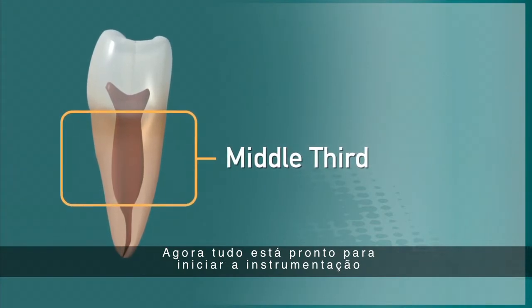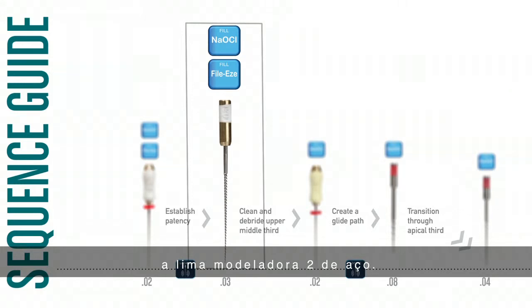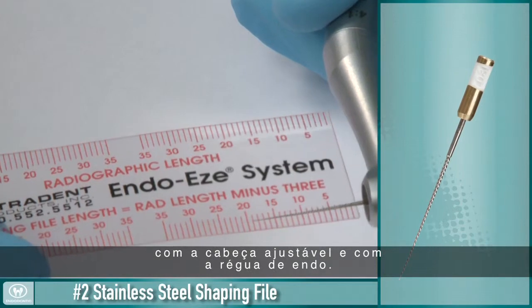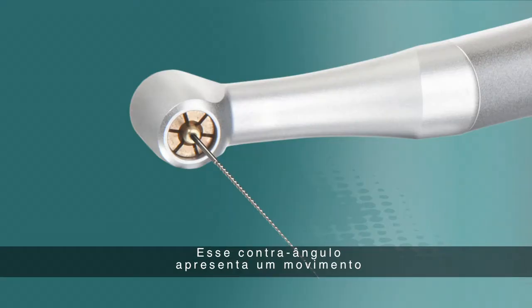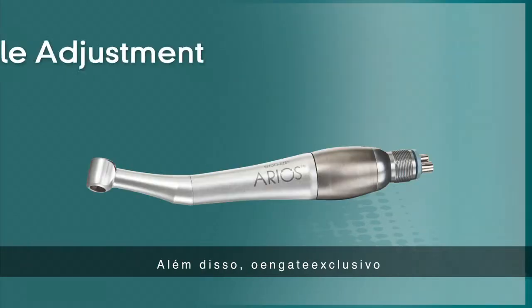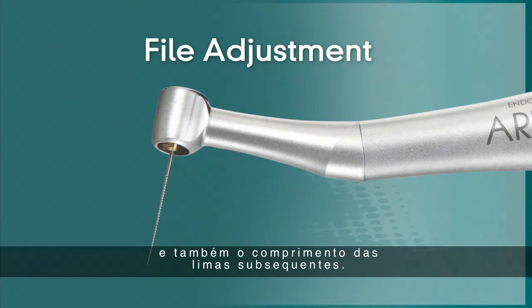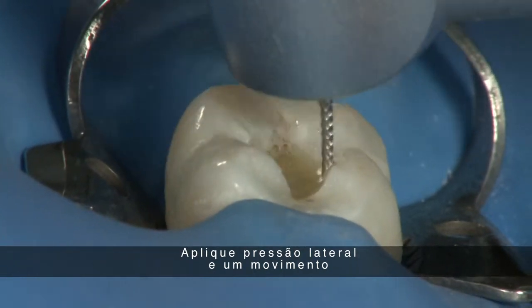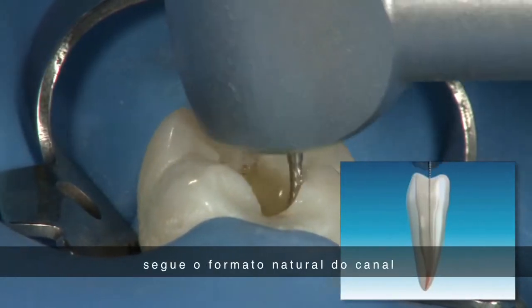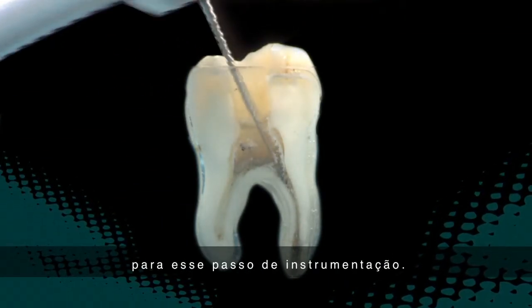You are now ready to begin instrumentation of the middle third of the canal. Referring back to the Sequence Guide, move from the No. 15 hand file to the No. 2 shaping file. Place the No. 2 stainless steel shaping file into the EndoEase Arios Contra Angle and set it to the working length using the adjustable head and EndoRuler. This Contra Angle features a 30-degree reciprocating motion that allows instruments to follow the natural anatomy of the canal wall while greatly reducing the risk of file separation. The unique chuck allows files to be adjusted by plus and minus 4 millimeters. Applying lateral pressure and a side-to-side brushing motion, gently clean the canal for approximately one minute, cutting on the upstroke. The stainless steel alloy provides the rigidity needed for this portion of the instrumentation.